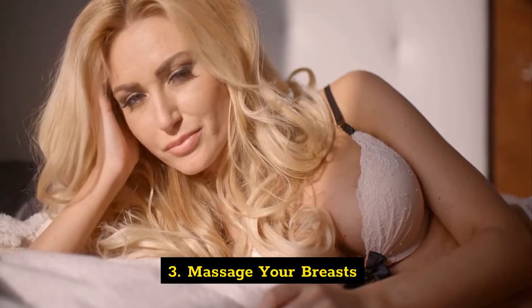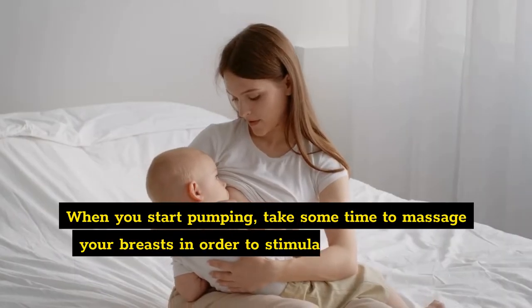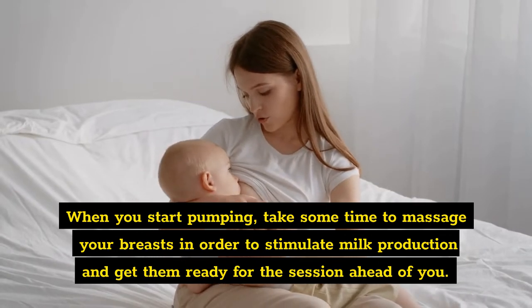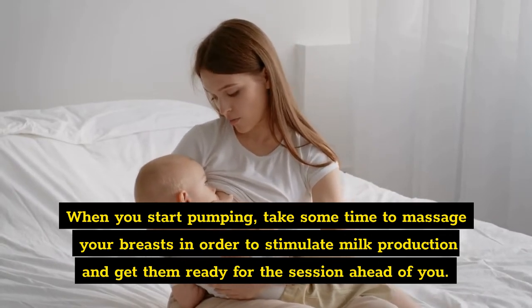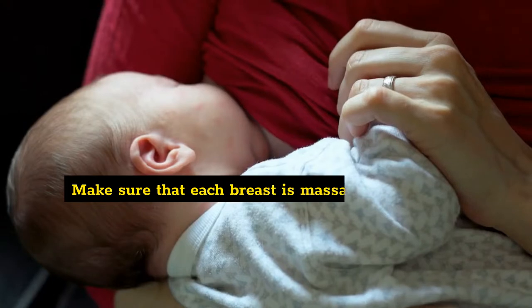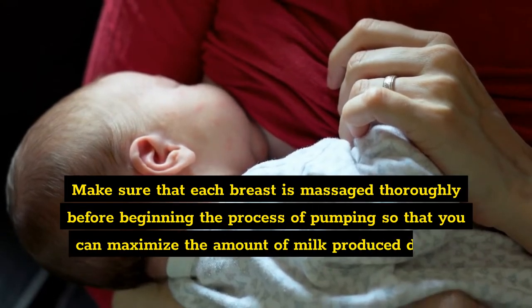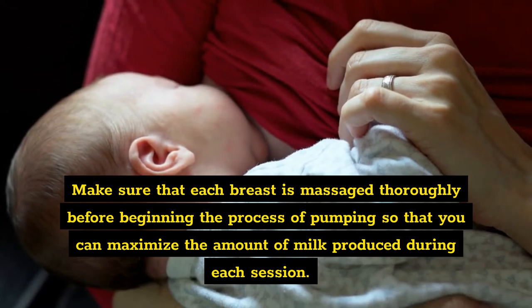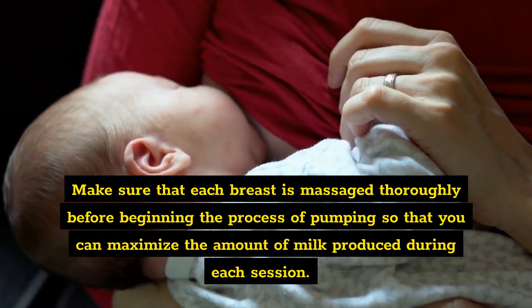Three: massage your breasts. When you start pumping, take some time to massage your breasts in order to stimulate milk production and get them ready for the session. Make sure that each breast is massaged thoroughly before beginning the pumping process so that you can maximize the amount of milk produced during each session.